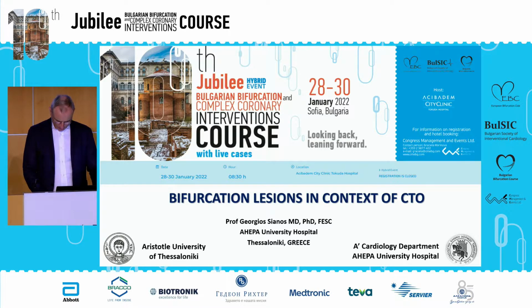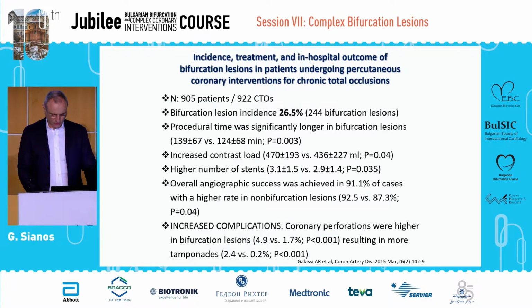We heard a lot about bifurcations yesterday, and we learned a lot. So we're going to address this specific topic, what is going on with CTOs in bifurcations in the context of CTO. There is not much literature because it's a very specific topic, but we have some data.